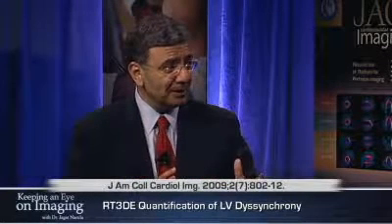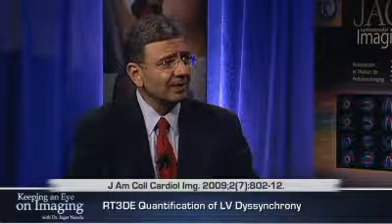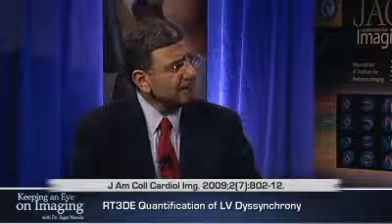In the normal individuals, we had a very low standard deviation in the contraction of the wall motion, and individuals with cardiomyopathy, irrespective of a bundle branch block or no bundle branch block, almost normal QRS complex, you had a large dyssynchrony with them. And this is somewhat an unexpected finding. That is absolutely correct. Why do you think so?